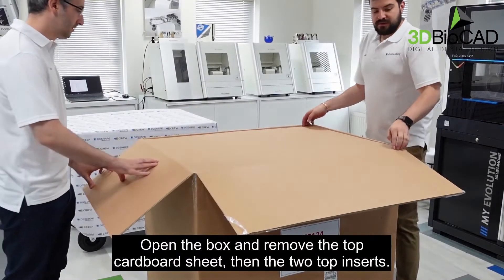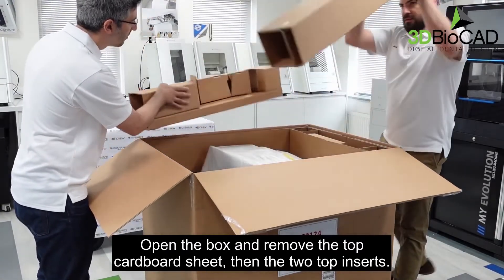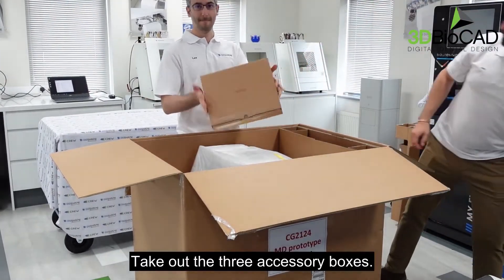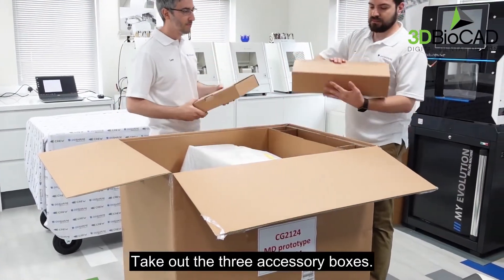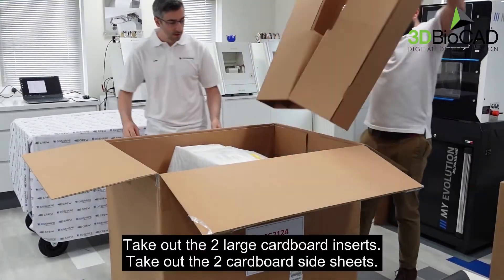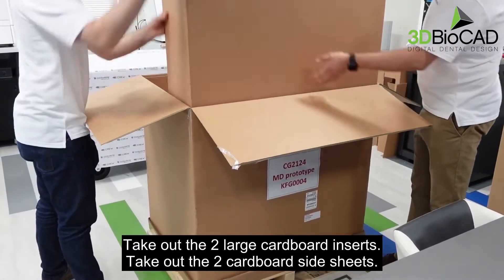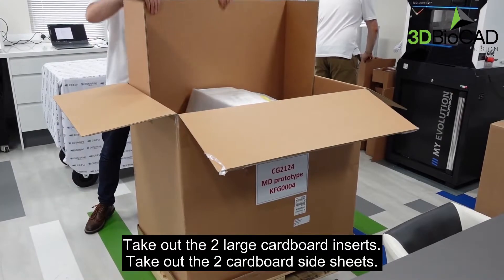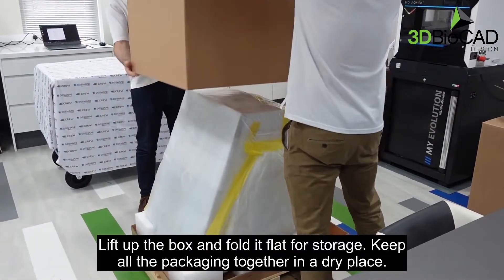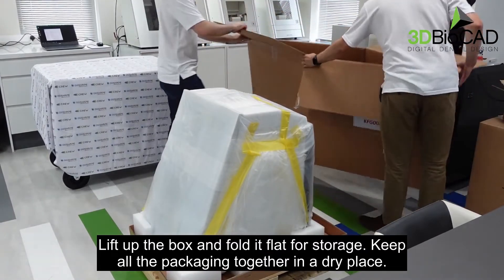Open the box and remove the top cardboard sheet, then the two top inserts. Take out the three accessory boxes, then the two large cardboard inserts and the two cardboard side sheets. Lift up the box and fold it flat for storage. Keep all the packaging together in a dry place.